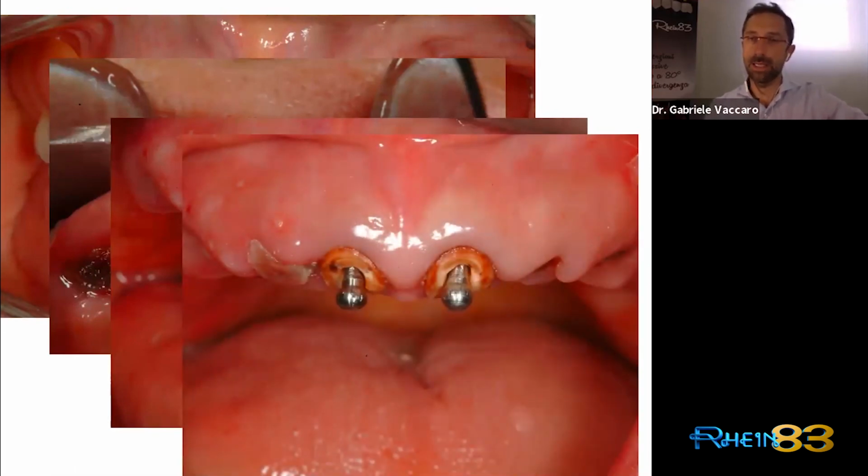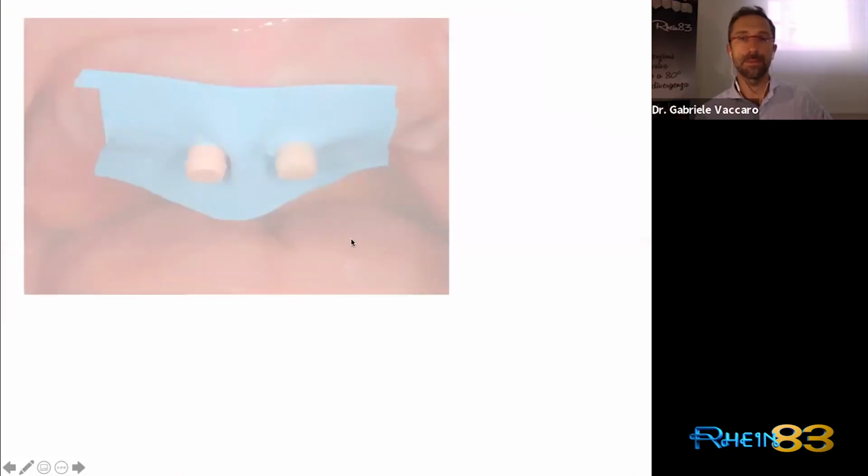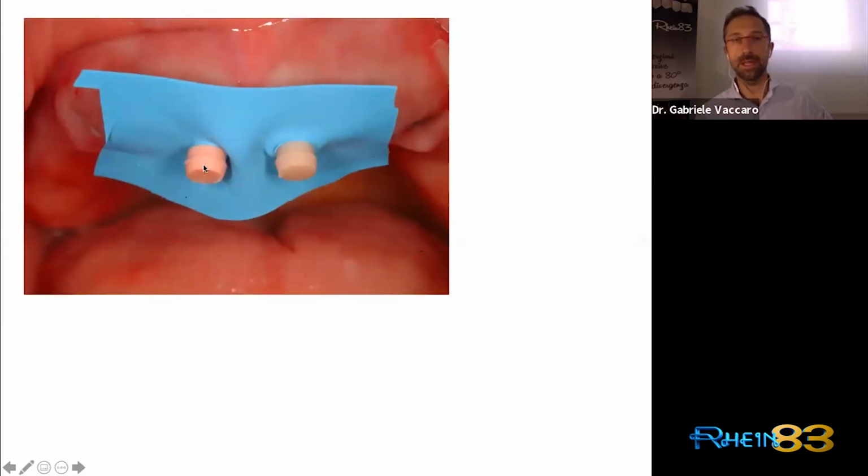And now the procedure is always the same. We have to make a proper root canal therapy, and then put the endo pivot inside. After that, always put a protection from the liquid resin. Otherwise, the resin will flow down the undercuts and it's impossible to remove it. I say it once again.